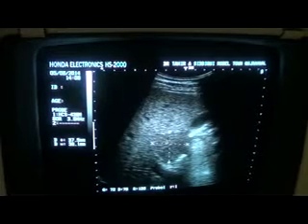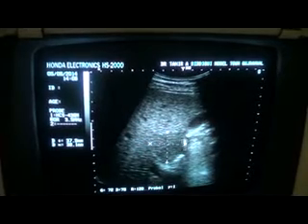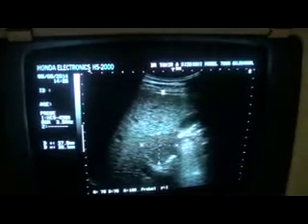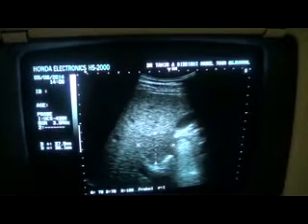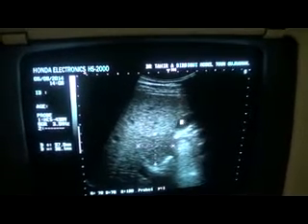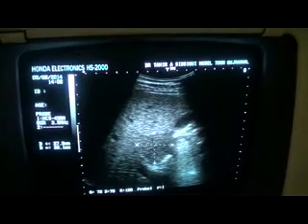This is not at all a case of HCC, because in all cases of hepatomas or aggressive pathologies of the liver, you will hardly see the outer surface of the liver so regular, smooth, and thin. The echogenicity of the liver would not be diffusely bright; rather, there would be coarseness — unless this is secondary, with the primary at some other location.